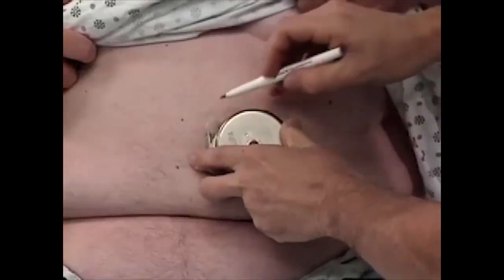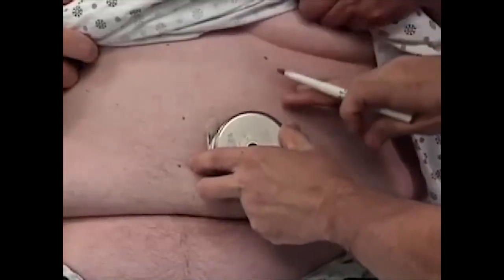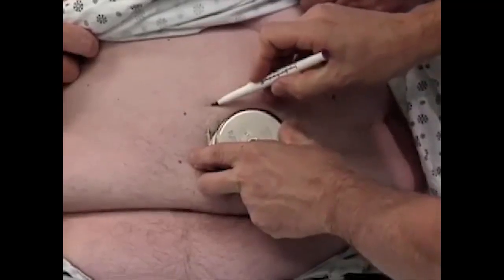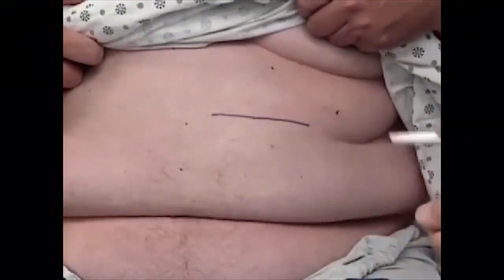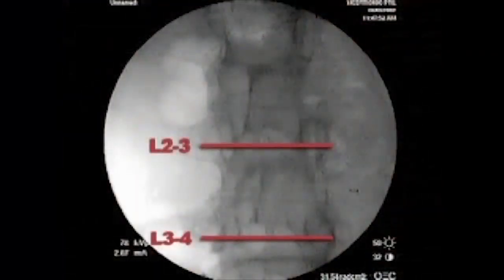Once the best position for the pocket has been determined, mark it clearly on the patient's skin with a marker. The use of prophylactic antibiotic treatment for the patient may also be considered. To begin, place the patient in a lateral position with the lumbar region slightly flexed. The side where the pump will be placed should be up from the table, and the patient's back should be perpendicular to the floor. A baseline fluoroscopy image should be taken to confirm proper positioning.